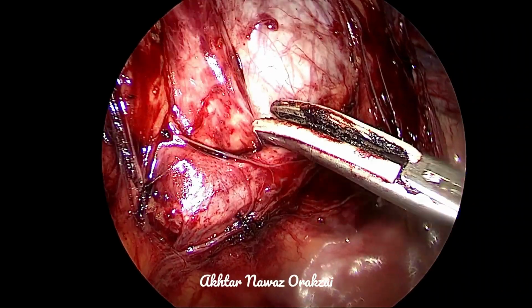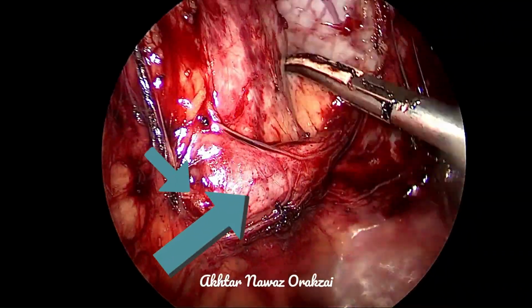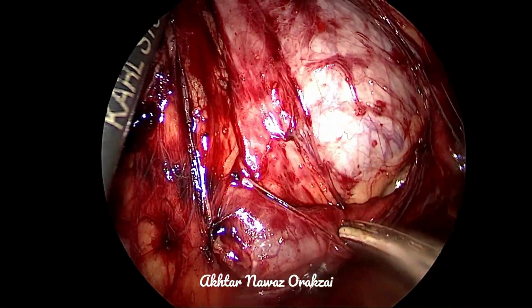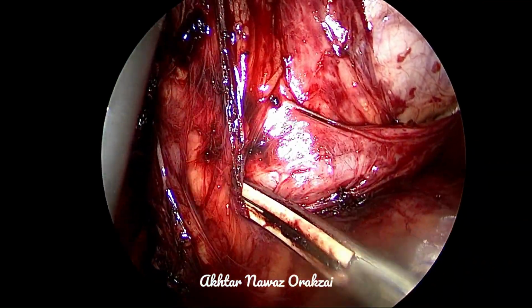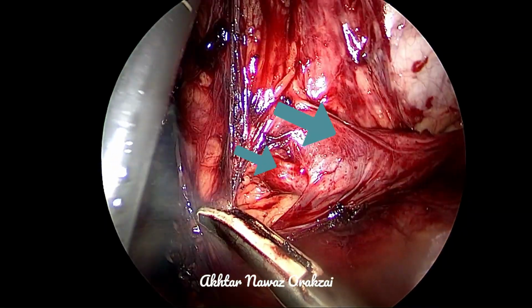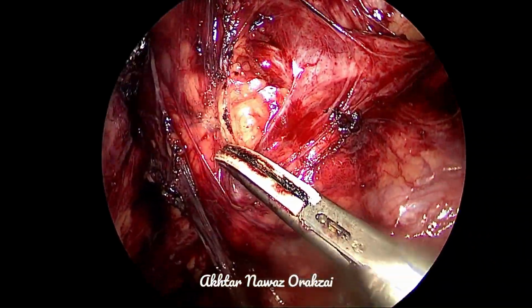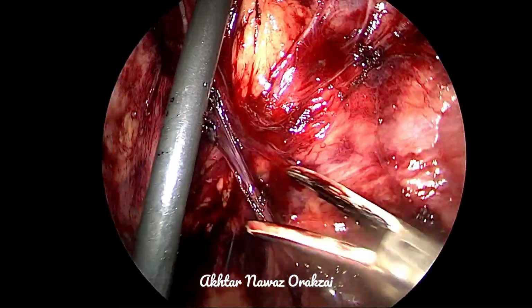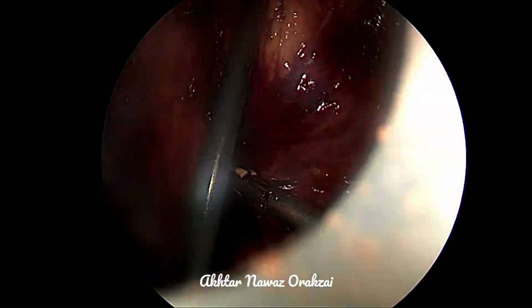So here you can see that the renal vein was visible higher up, and this is the lower pole of the kidney and the lower polar vessels. The gonadal vein is draining into the renal vein, and the vein from the lower pole, which is draining the lower pole, is joining the gonadal vein, and both of them are then going into the inferior vena cava.